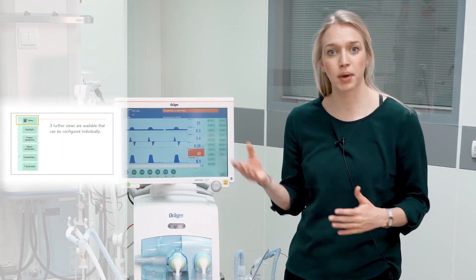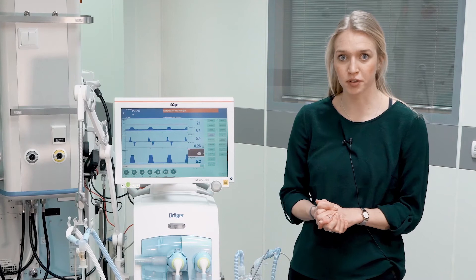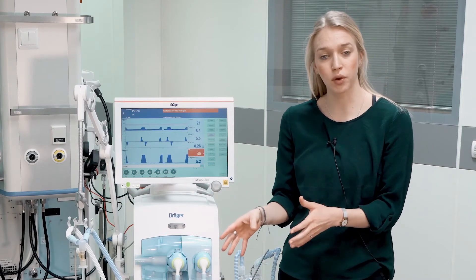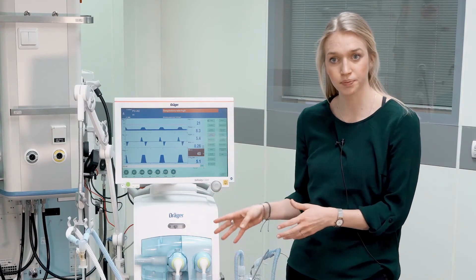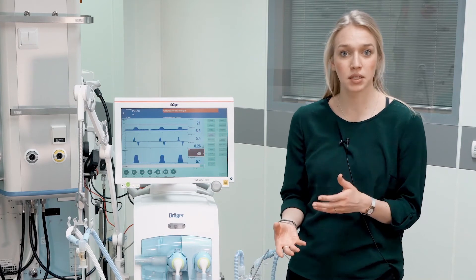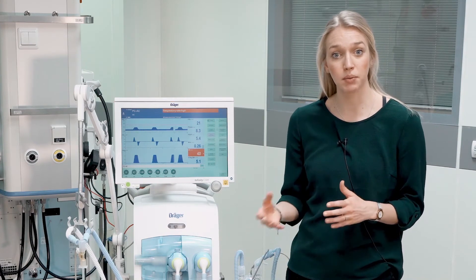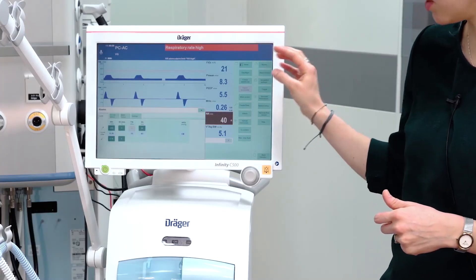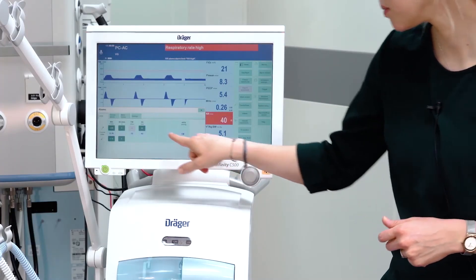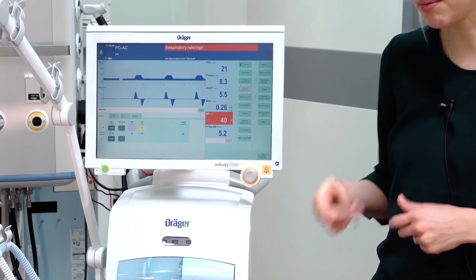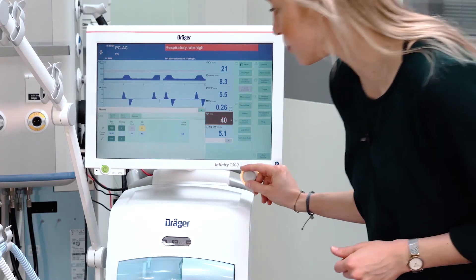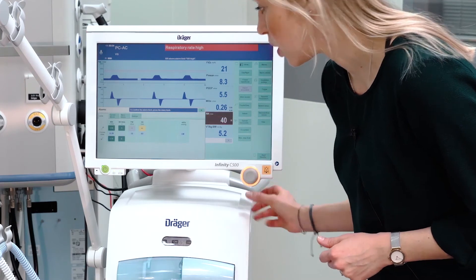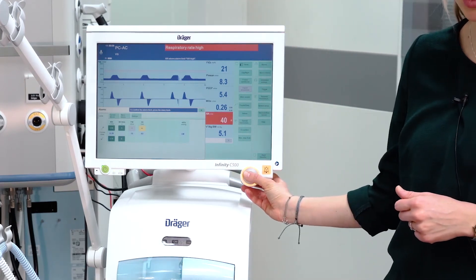If an alarm is present, the BabyLog will give you a visual and an audible feedback. Please always check the condition of your patient and of the breathing system. However, it might become necessary that you want to adapt alarm limits during operation. Please select the menu alarms, select the respective alarm limit and turn it to the desired value. You can confirm by pressing the rotary knob.